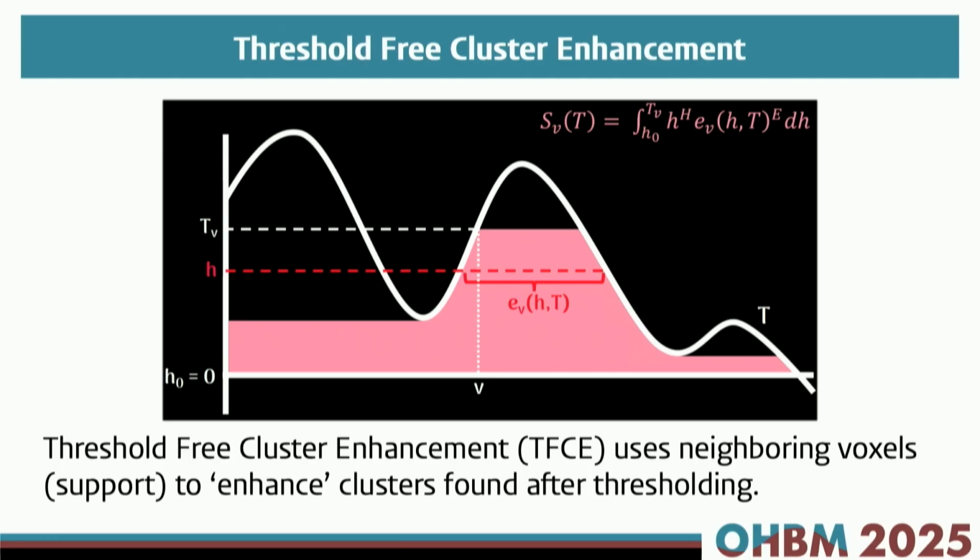You could also do this method, TFCE and LCE, with a higher threshold. So you can set a threshold beforehand. And what we found is that it's usually more powerful to have a somewhat higher threshold. It is basically because these support regions, the low T values, are all taken into account in the statistic, but they don't really add much to the data, right?